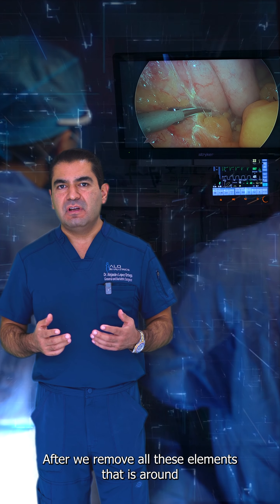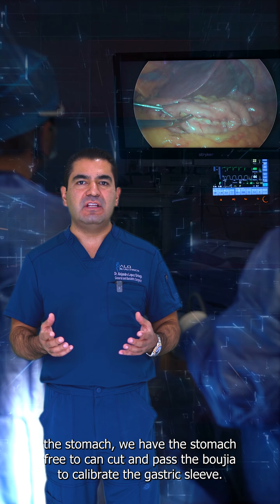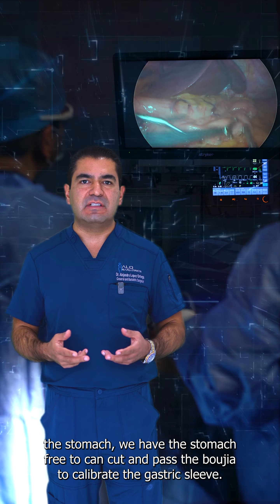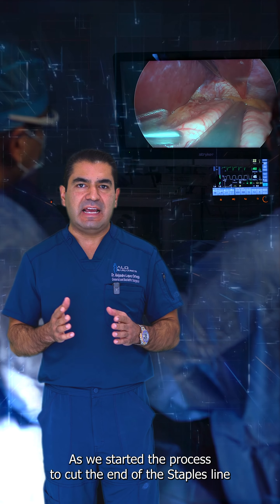After we remove all these elements that are around the stomach, we have the stomach free to cut past the bougie to calibrate the gastric sleeve as we start the process to cut at the end of the staple line.